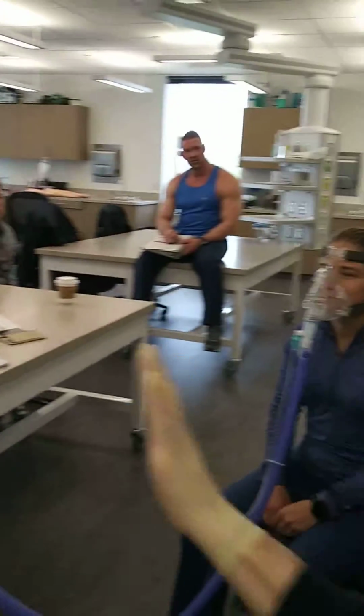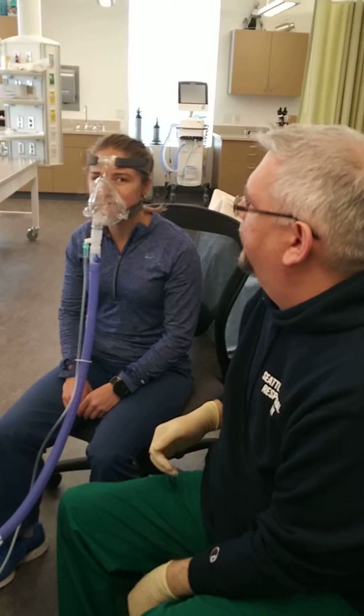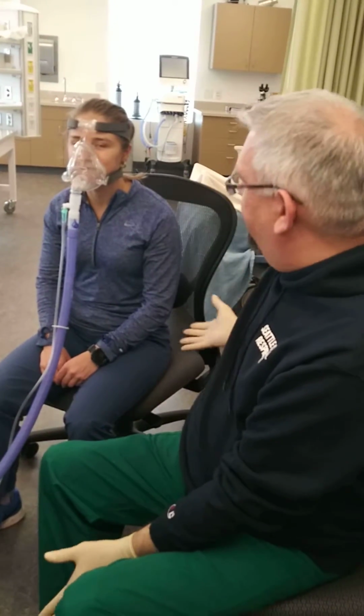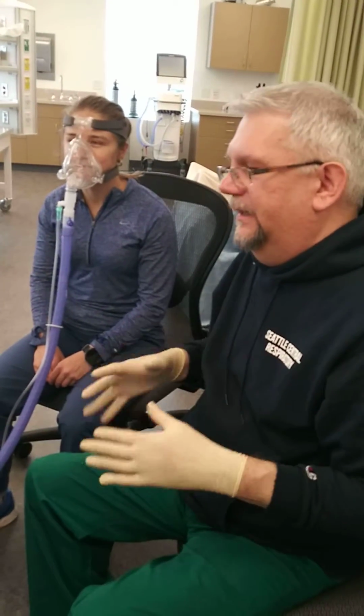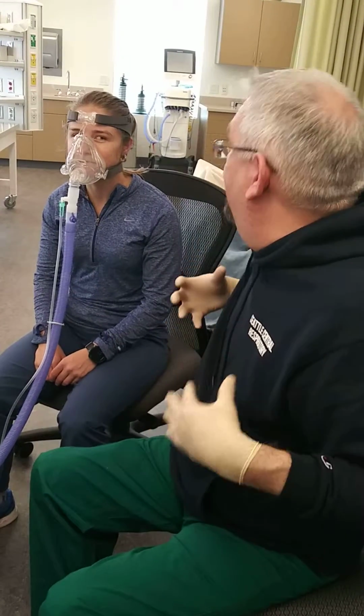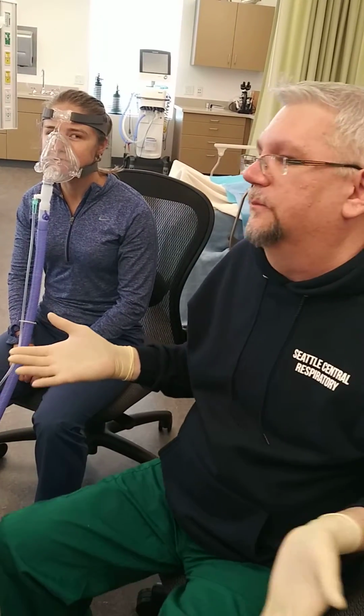And so I haven't even paid attention to the machine. I don't care. I might hit alarm silence a couple of times, let it scream, whatever. I know what I've done here. I set some settings. Once she's in here and she's breathing a little bit, I'm going to start to ramp it up so that you can start feeling what it actually feels like. And then when I get kind of stabilized, then I would go in and set my alarms.